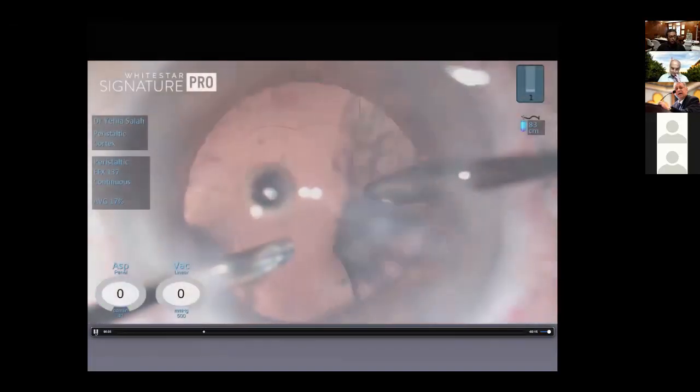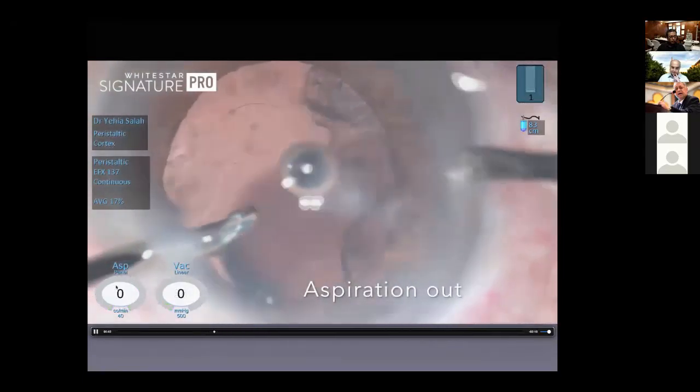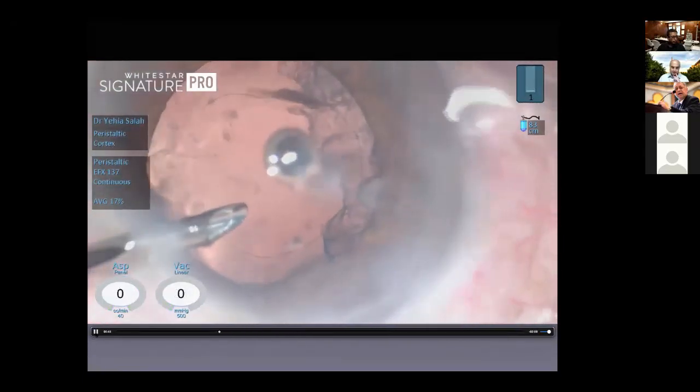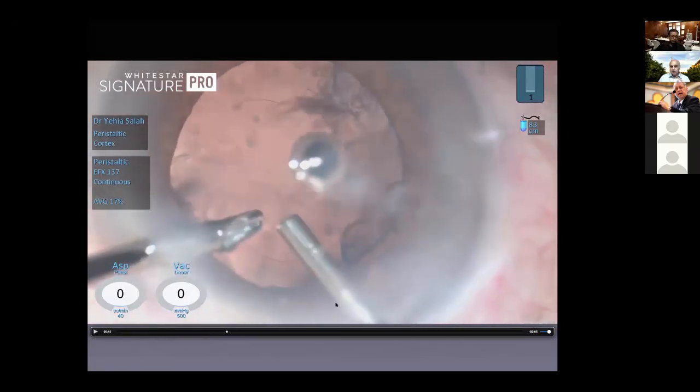So I stop, see if there is vitreous or no vitreous, and evaluate how much is the opening. If there is vitreous, I have to deal with the vitreous. If there is no vitreous, I have to make sure I don't introduce or make vitreous loss. So first thing, you identify there is a problem. You see the opening? So notice what I did.